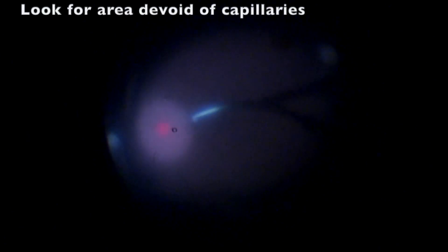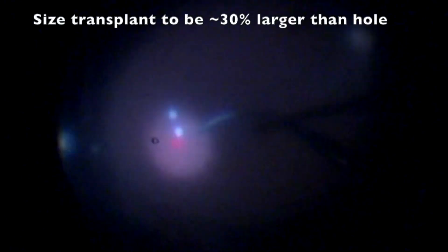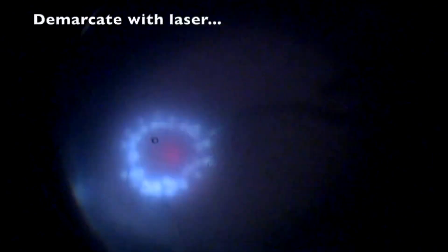A superior harvest site in a relatively avascular area is recommended. The graft area should be 30% larger than the macular hole, so both endolaser and diathermic marks should be performed around the graft.